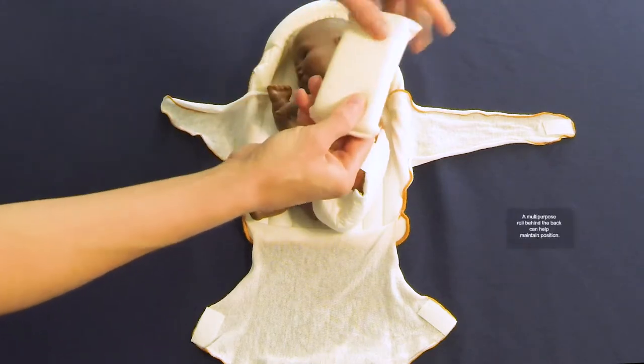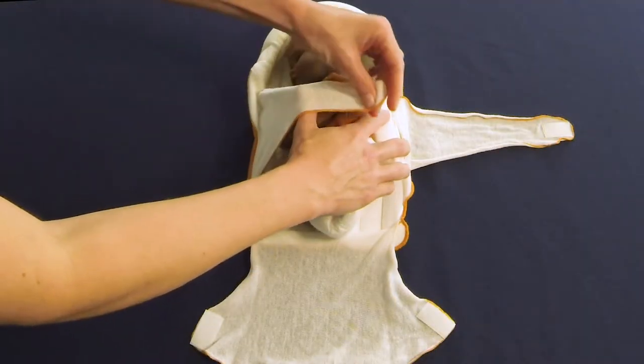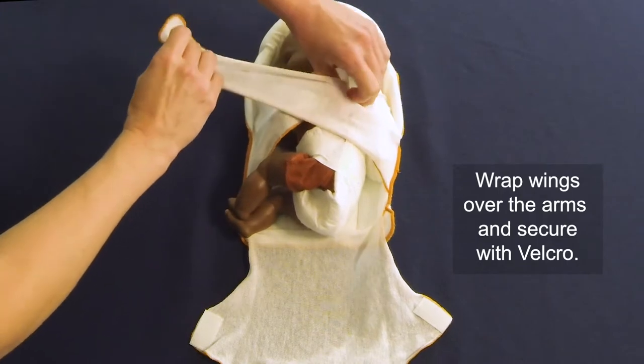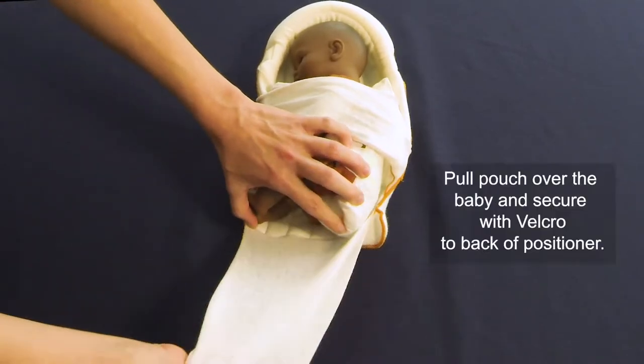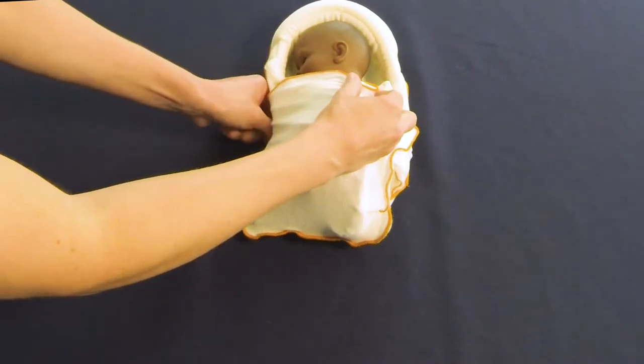Side-lying may not require use of the multipurpose roll, although some may find it beneficial to lay it behind the baby for additional positioning support. Pull the short wing over the infant and roll, ensuring shoulders are rounded forward. Wrap the longer wing over the shorter wing and attach with Velcro to the back of the positioner. Keeping the baby's legs flexed, pull up the pouch around the baby and attach the Velcro strips on the back.